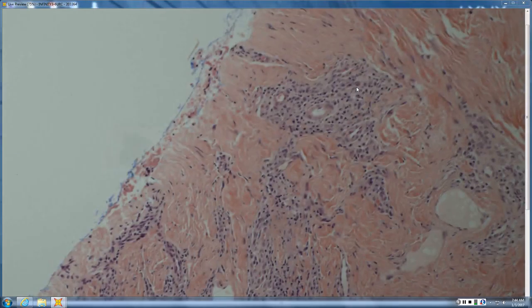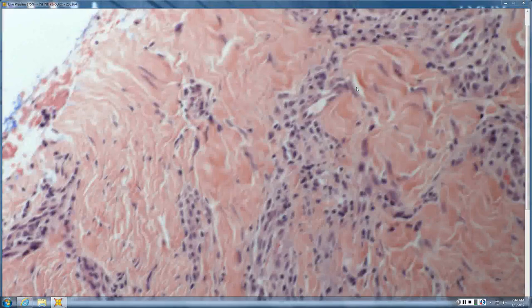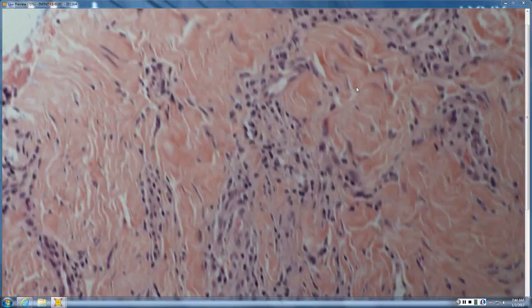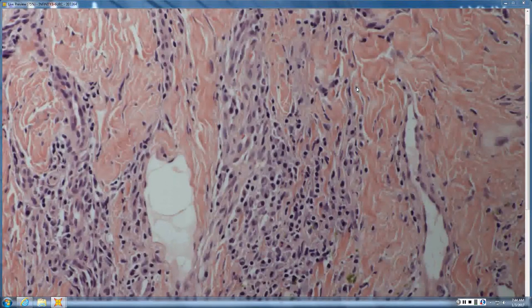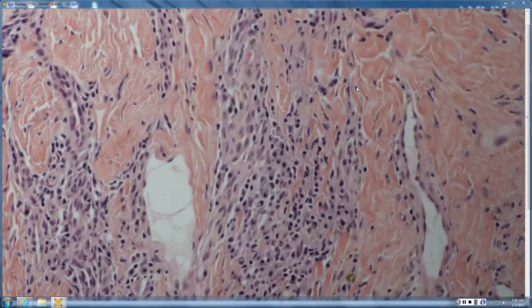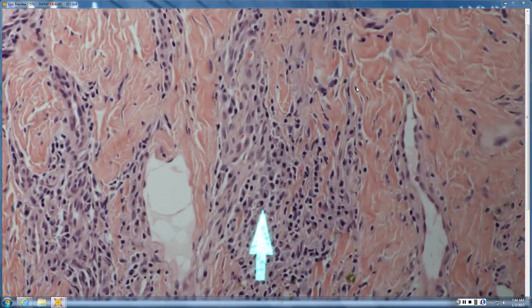Acne keloidalis nuchae. And one of the clues would be if you look at the inflammatory component, and there are lots of plasma cells. Mm-hmm. So the neck. That can be a clue to location that you're on the neck, and here there are tons of plasma cells, so AKN would be the most likely. Correct. Well done.